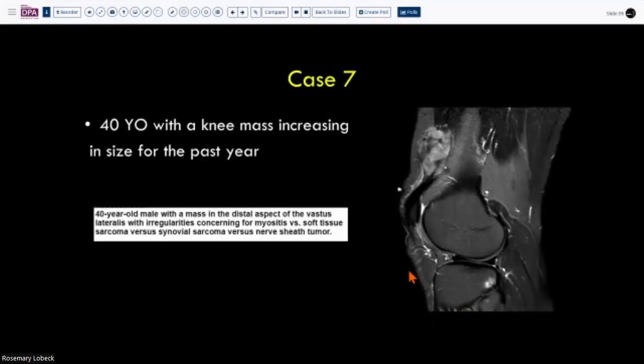So this case, I want to quickly go through this. We have a couple of minutes here. 40-year-old patient with a knee mass increasing in size for the past year. So here you can see the mass. And then the surgeons are like, oh, we don't know what this is. It could be benign, malignant, whatever, right? And then you can see here there is a patella, and then this is actually the patellar tendon. And the lesion is sitting right bang in the middle of the patellar tendon.